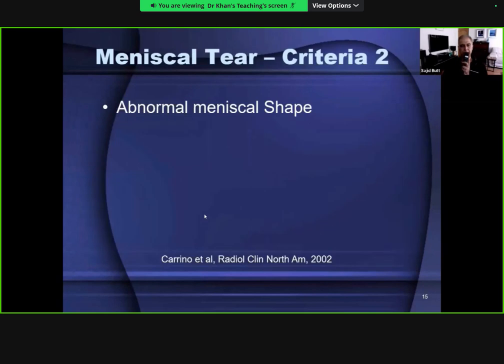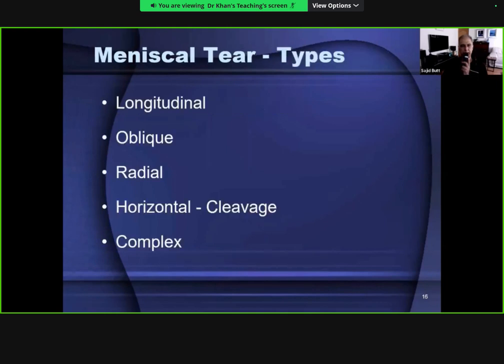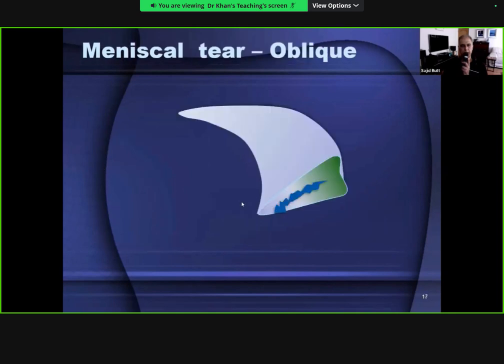The second criterion is a meniscus with abnormal shape - it has lost its bow tie or has a missing segment of meniscal tissue. Tears can be longitudinal or horizontal cleavage. A horizontal tear divides the meniscal tissue into upper and lower halves, whereas a longitudinal tear divides it along the longitudinal axis of the meniscus.